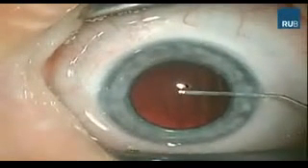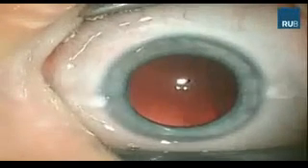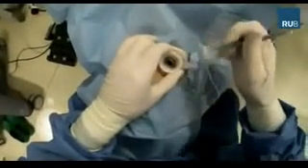The eye is now prepared for the posterior laser capsulotomy by filling the anterior chamber with Healon. Then a redocking is performed using a manipulation device because the general anesthesia slightly lost depth at this point.